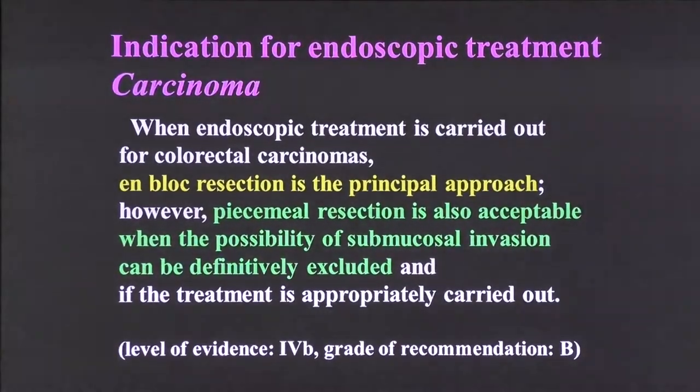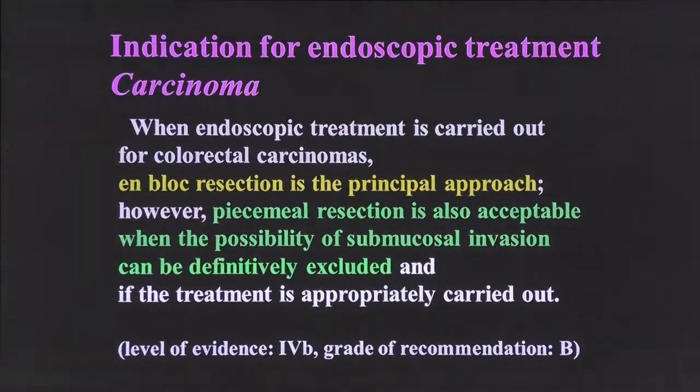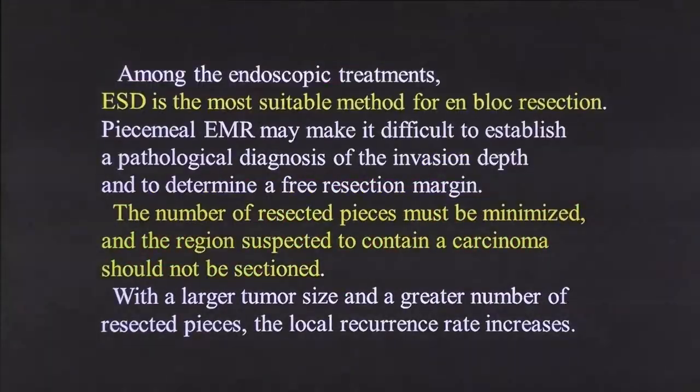So there are some statements in Japan's guideline. In the treatment of carcinoma, en bloc resection is the principal approach. But piecemeal resection is also acceptable when the possibility of submucosal invasion can be definitely excluded. ESD is the most suitable method for en bloc resection.